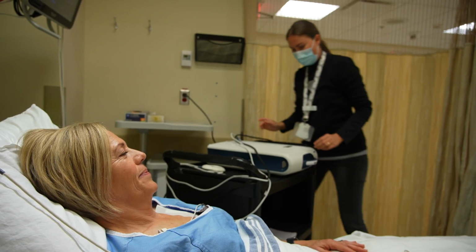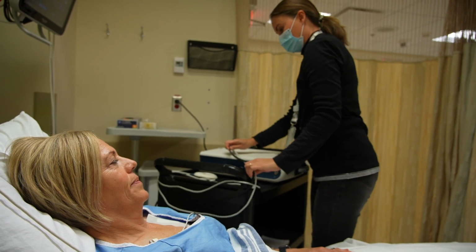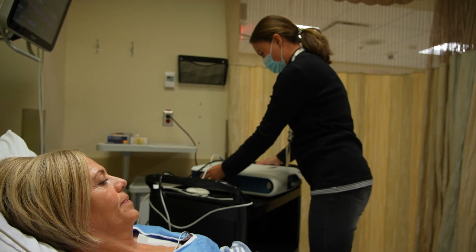The nurses will frequently check your wound site, your vital signs. You will need to stay in bed for about 1 hour after your procedure and not lift your operative arm above your head. You will be allowed a drink and a snack immediately after, as long as you are not drowsy or feeling unwell. Once you have spent an hour resting, your nurse will help get you to sit up at the edge of the bed and go for a short walk.